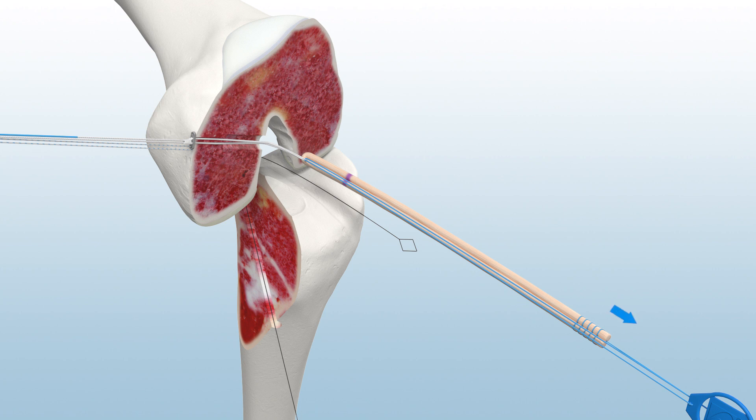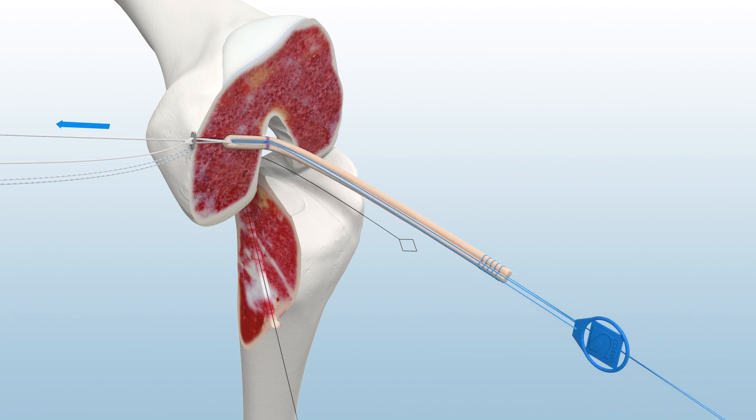Distal tension on the graft construct will confirm seating. To tension the graft loop, drop the lead sutures and pull only the tensioning suture with the blue suture tag while simultaneously applying distal tension on the graft construct.